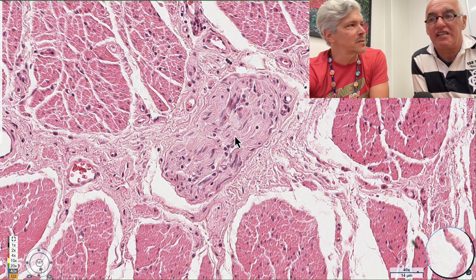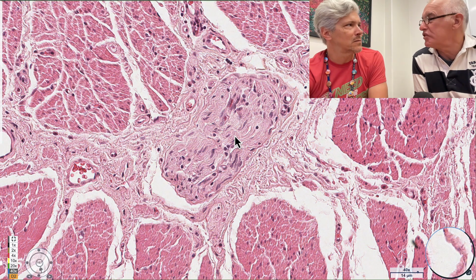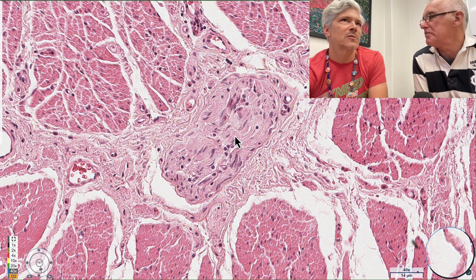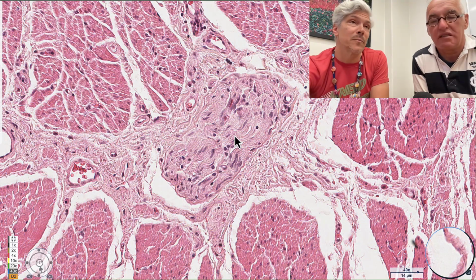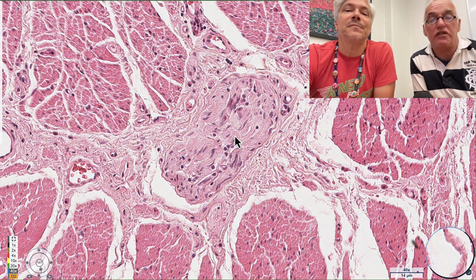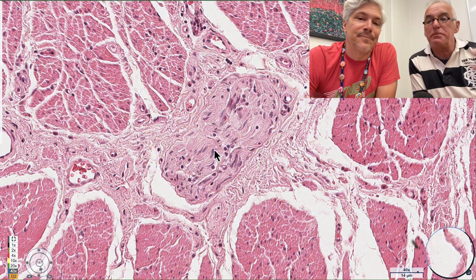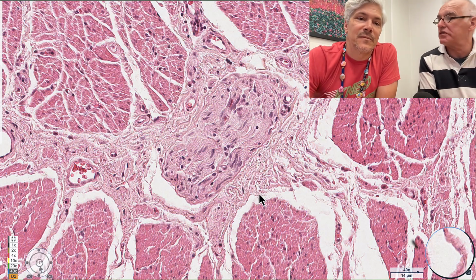What's the one up top? Is it mucosal? It'd be the submucosal plexus. It's in the submucosa. We did see a little batch of nerve in the submucosa. That's right. So it may well be, but that's for the future. Just for now, we've got some really chunky nerve. That's right. And it's between those two layers of muscle. That's the place you find it.